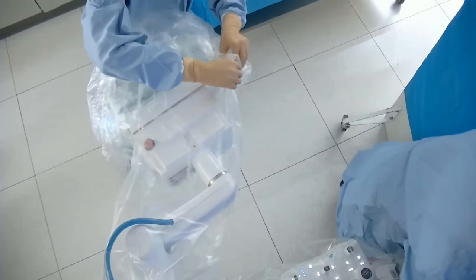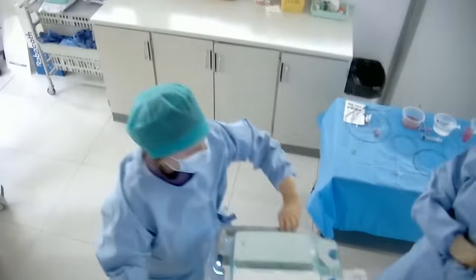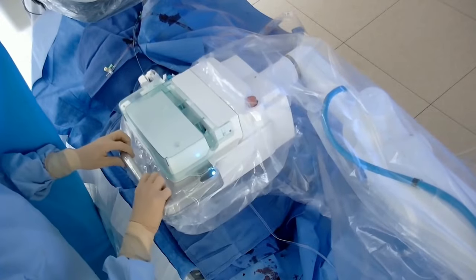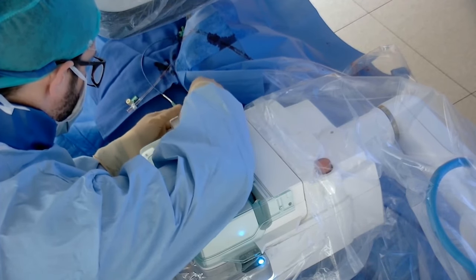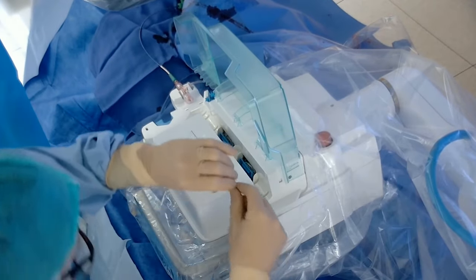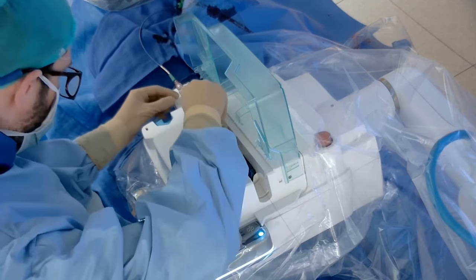Okay, so we have to move to the cath lab in order to see. So we decided to perform the angioplasty with the robot assistance. For LAD-PCI with robotic assistance, the first step is to cover the robotic arm with sterile wraps. Then the robotic drive is positioned at the right height in line with the arterial sheath. The Y connector is loaded into the proximal part, securely in place within the single-use cassette. Then we open the single-use cassette, which is where the interventional device will be loaded.